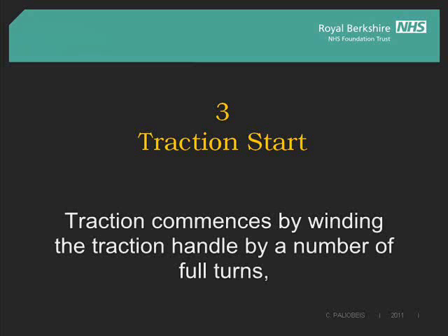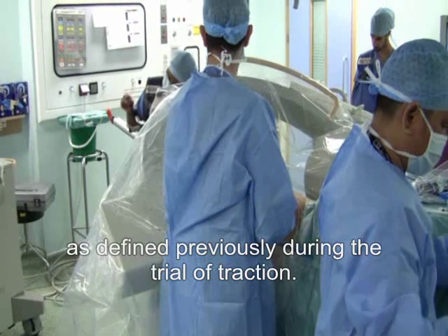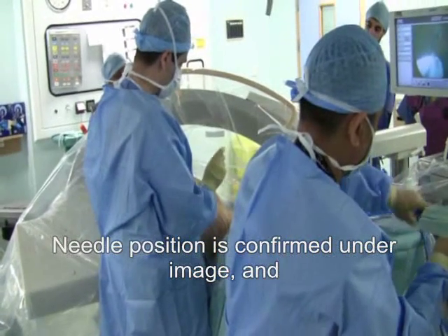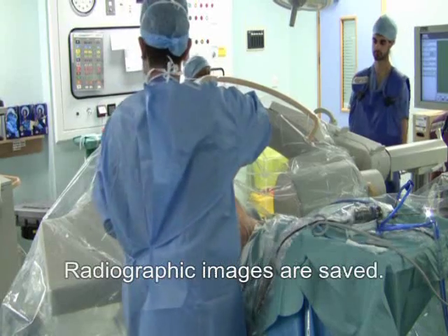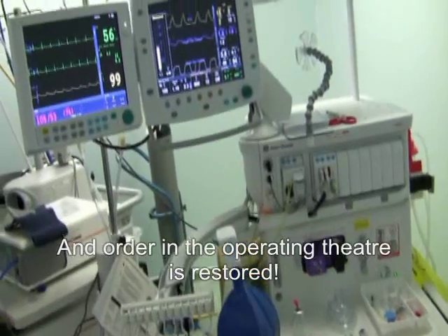Traction commences by winding the traction handle by the number of full turns as defined previously during the trial of traction. Needle position is confirmed under image and the radiographic vacuum sign is abolished with the help of up to 40 ml of fluid which is injected. Radiographic images are saved and order in the operating theatre is restored.